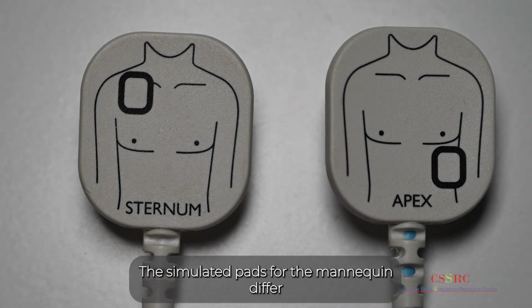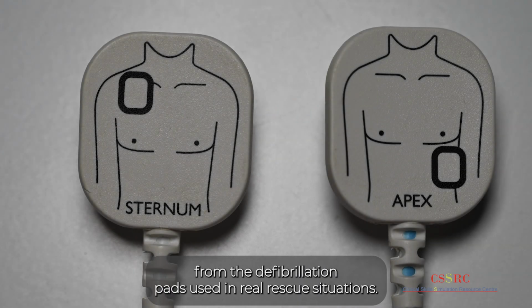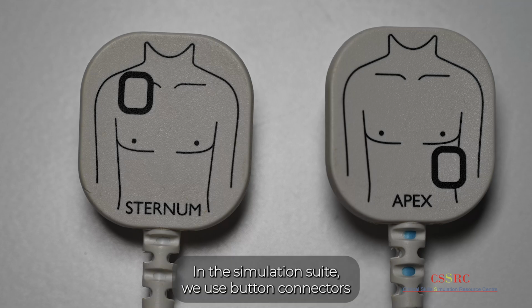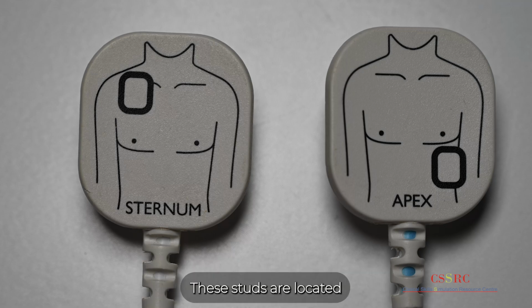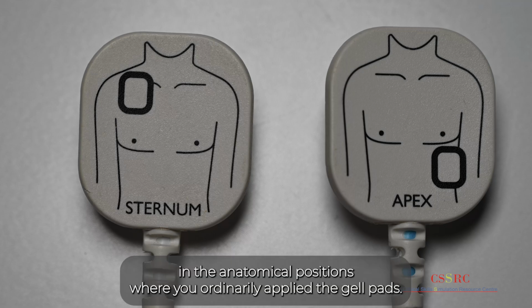Okay, so we're going to head in now to the cardiac arrest situation. The simulated pads for the mannequin differ from the defibrillation pads used in real rescue situations. In the simulation suite, we use button connectors that attach directly to the defibrillation studs on the mannequin's chest. These studs are located in the anatomical positions where you ordinarily apply the gel pads.